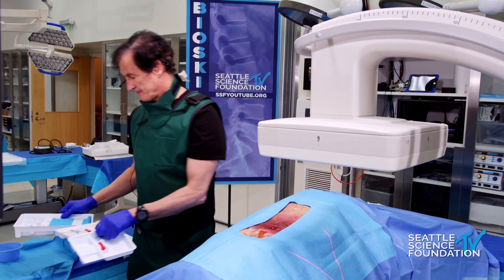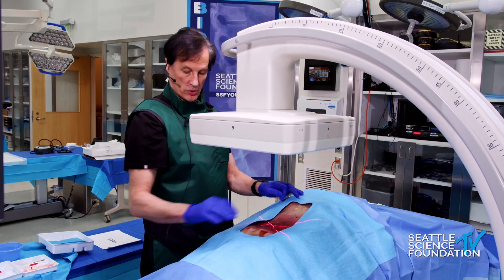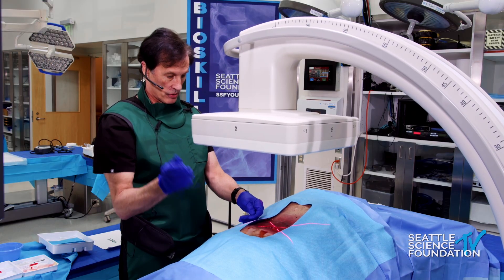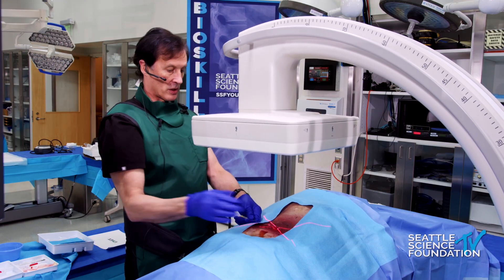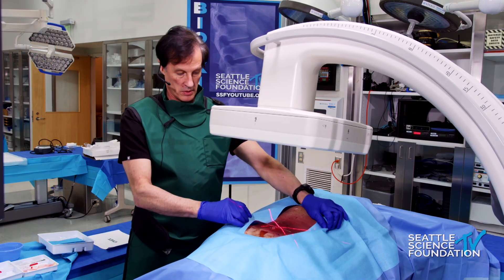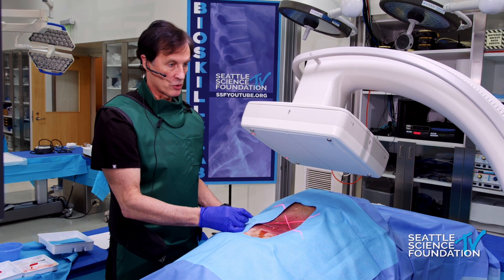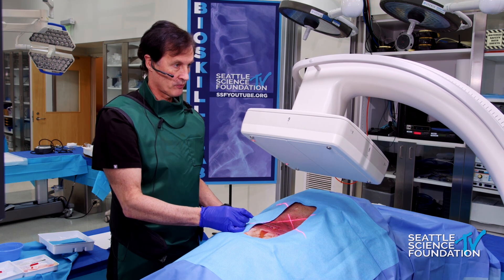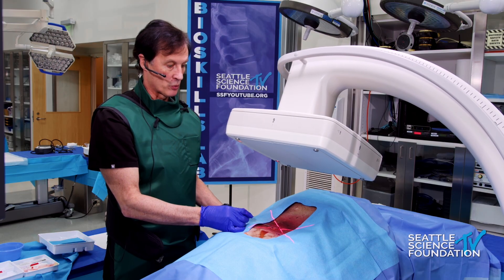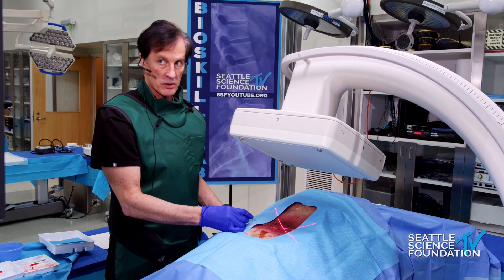We'll have intradiscal access. Go ahead and bring it in, arc about 35 degrees toward you, give me a little bit of cranial angulation. Arc about 35 degrees toward you — that's enough. Arc toward you, that's good.